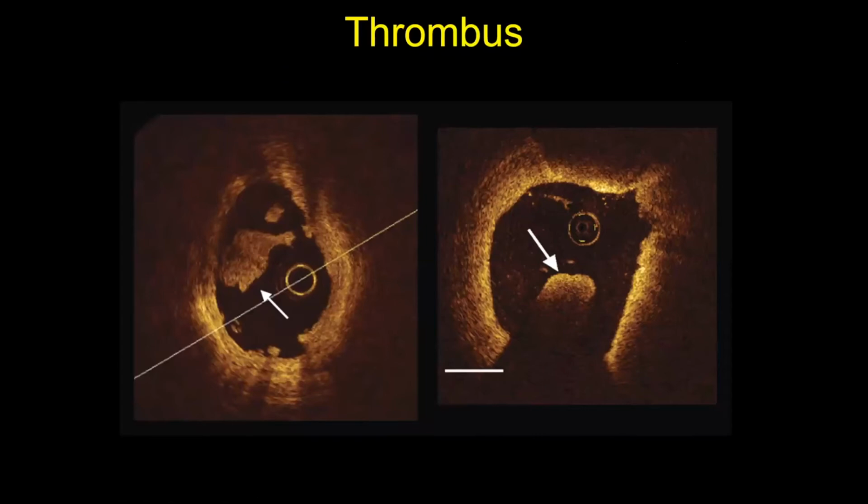Okay, we have talked about thrombus. I would like another member to comment on the basis of what we have already talked about, the thrombus and the two types of thrombus.